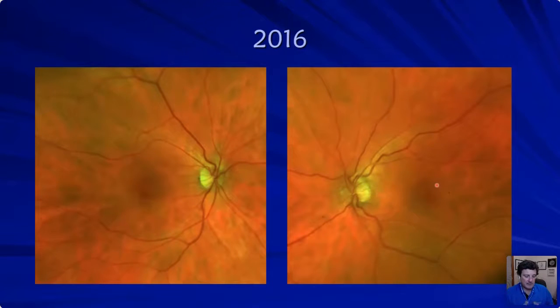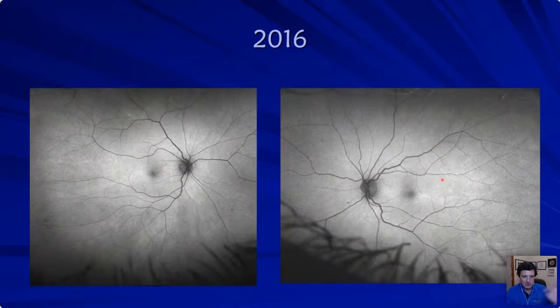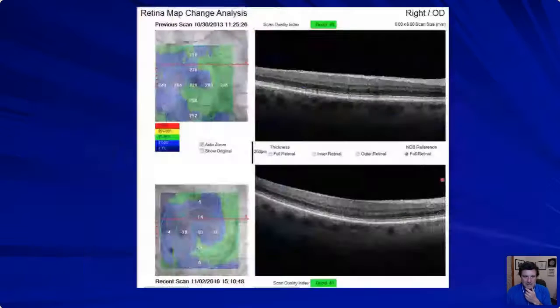The patient was being followed, got sick and tired of sitting forever in the ophthalmology practice, and complained to the rheumatologist. I really like Greg. He explained a lot of stuff, blah, blah, blah. The rheumatologist said, hey, that doesn't really hurt. Why don't you jump over and get another opinion? So I didn't see her for 3 years. She comes back, and here are her pictures. No bullseye maculopathy. Everything looks good here on the autofluorescence testing.